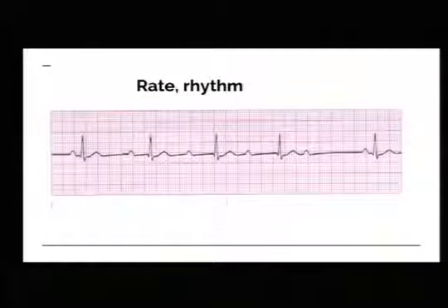Okay, what about this one? Yep. So you've got a Mobitz 1 because you've got PR, PR lengthening, dropped. Starts over. So, Wenckebach.